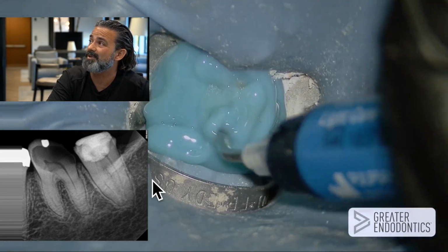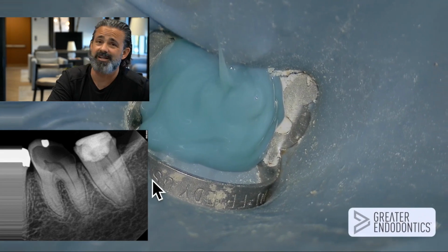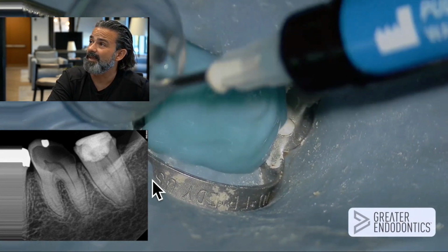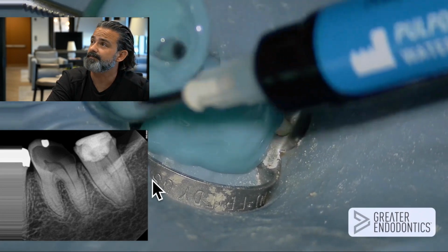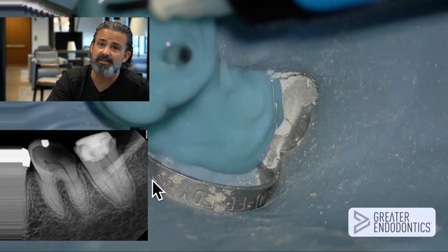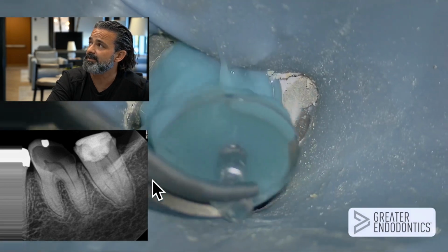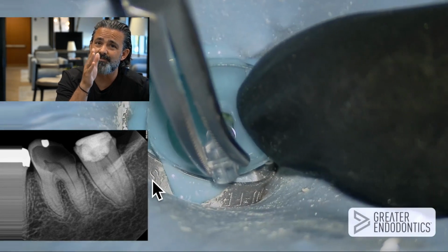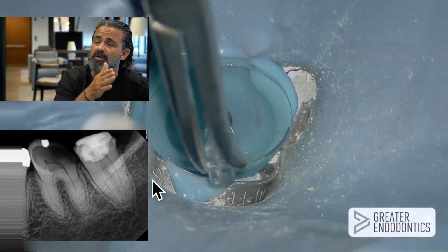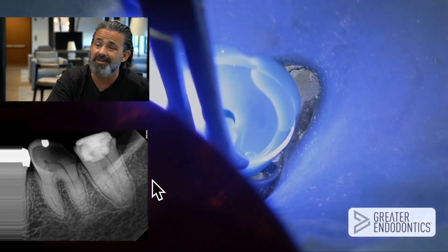And now what I'm doing is I'm making an ugly mud pie, but it's a sound seal mud pie. And then I'm going to kind of cover up the platform matrix, just the intaglio surface of that, and I'm going to connect the dots here. I'm using hemostats. I'm keeping the little notch towards the mesiolingual or mesiobuccal line angle because of convenience form. You can pretty much put it anywhere, to be honest with you.